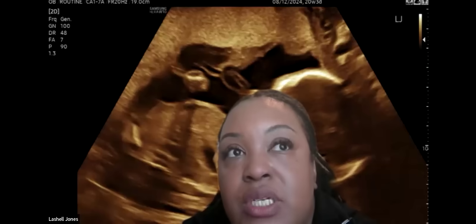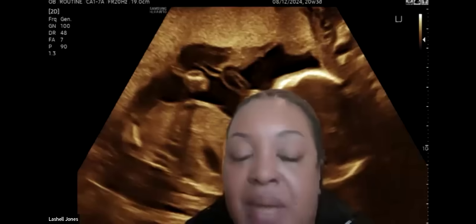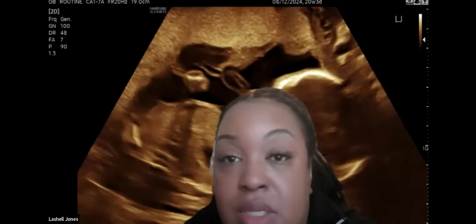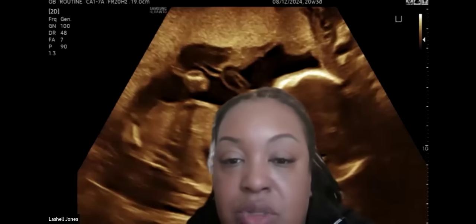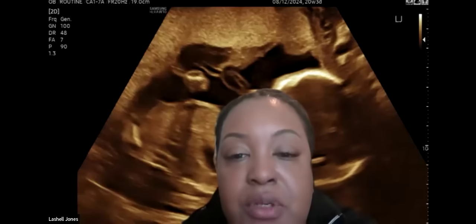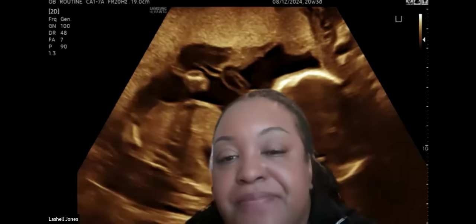I tell a lot of my students, if you see something, don't say, "Oh, I'm making that up." A lot of times my students aren't as confident to call it. So I tell them, if you question something, just bring it to the doctor's attention and have them take a further look in those cases.